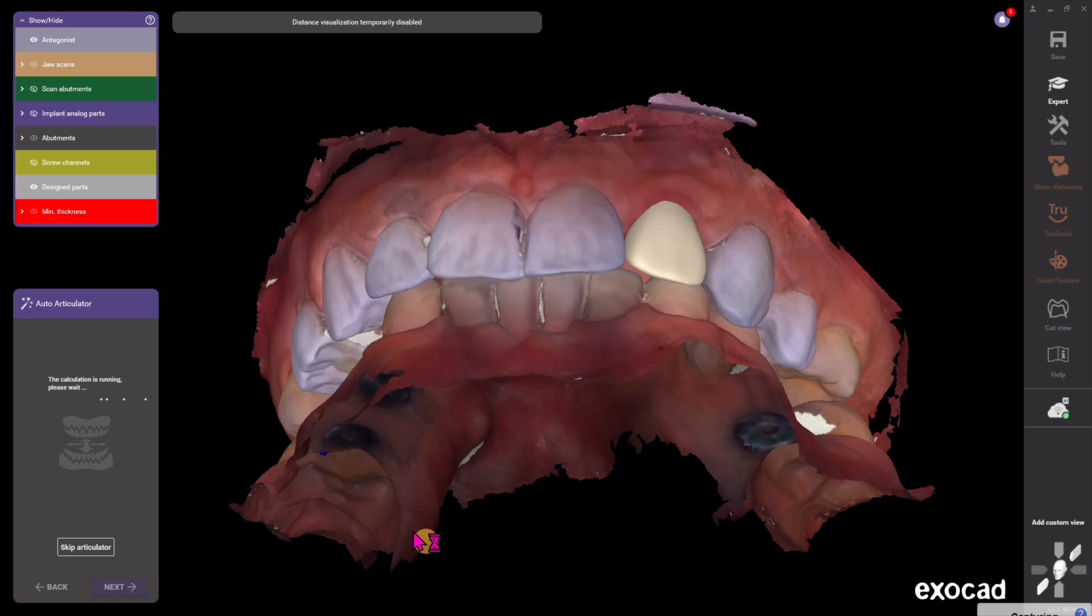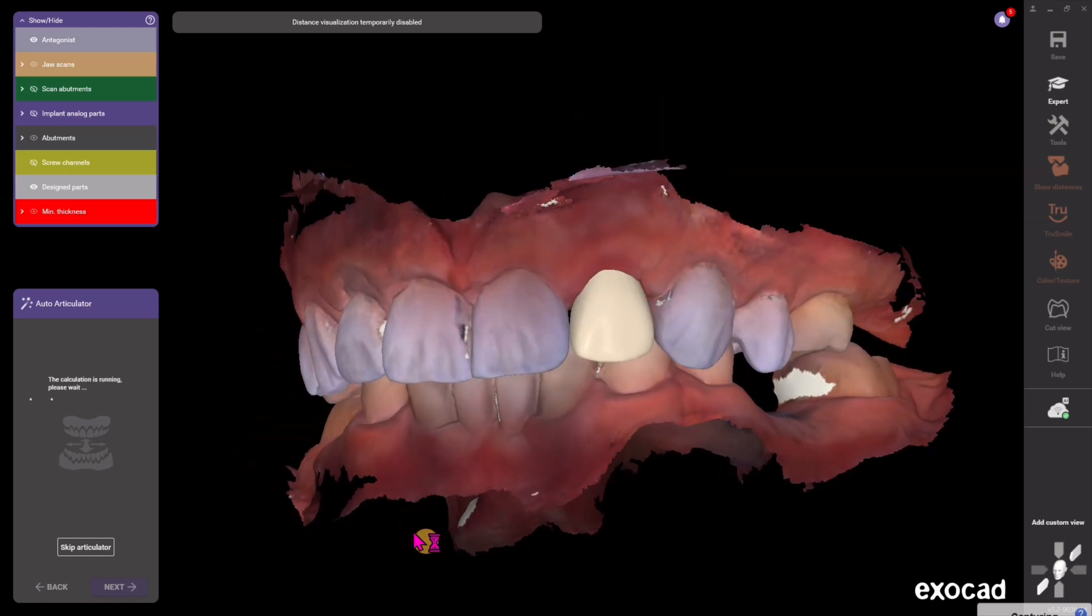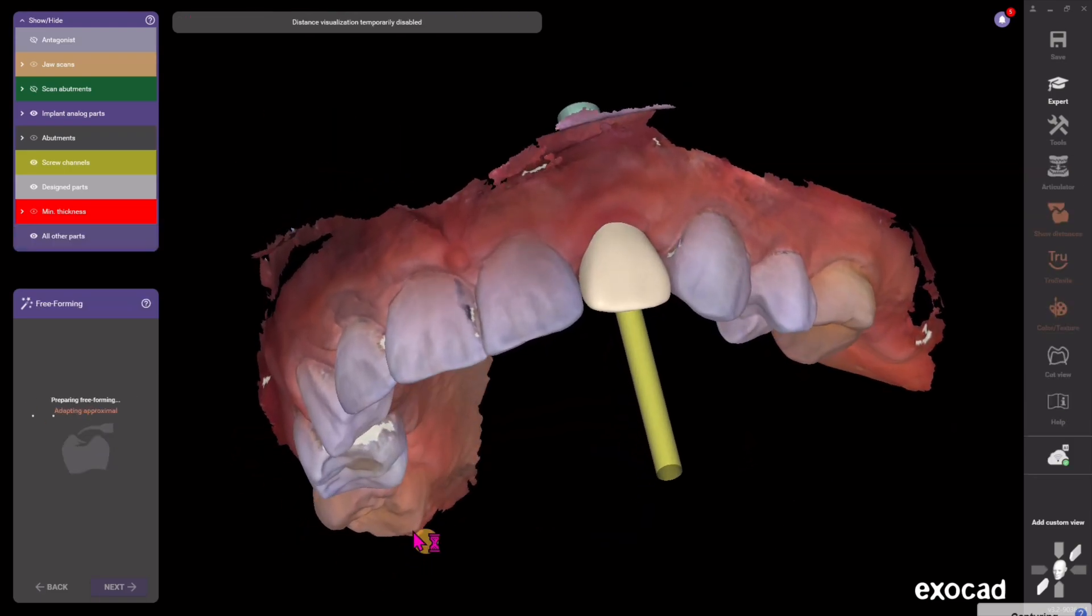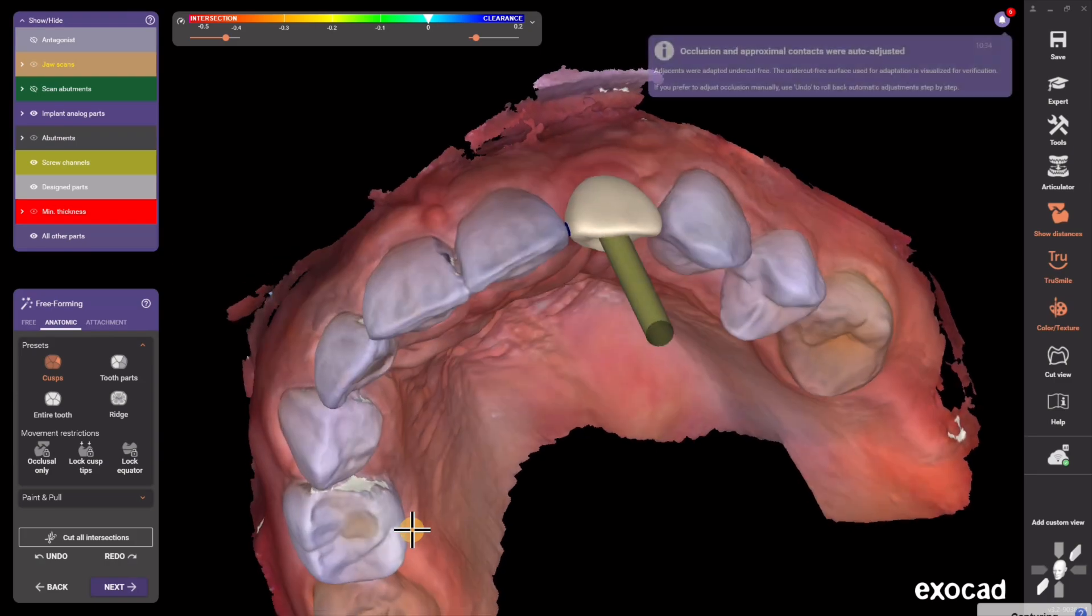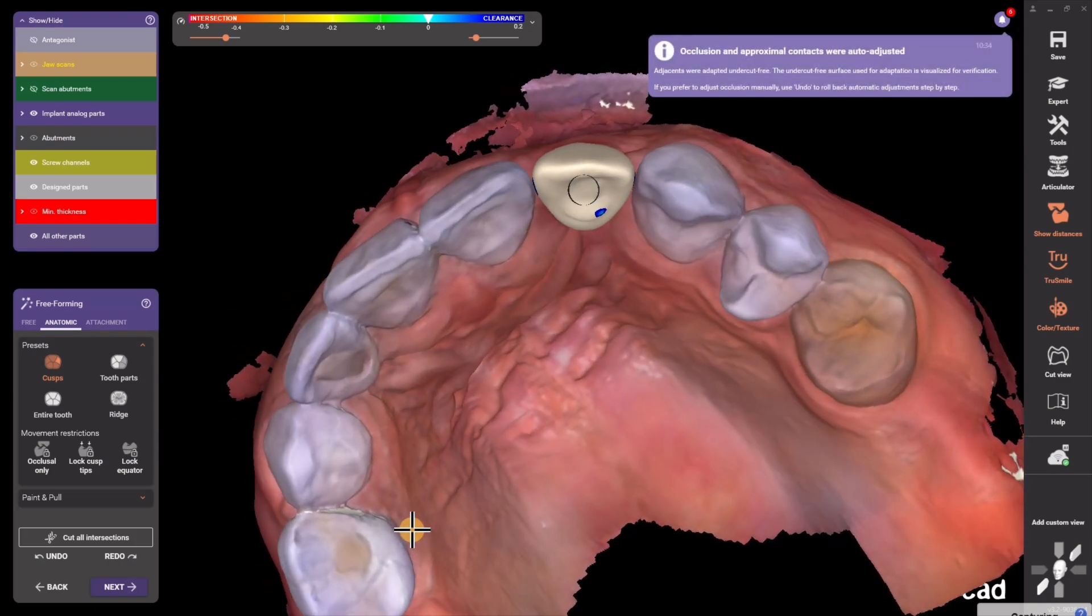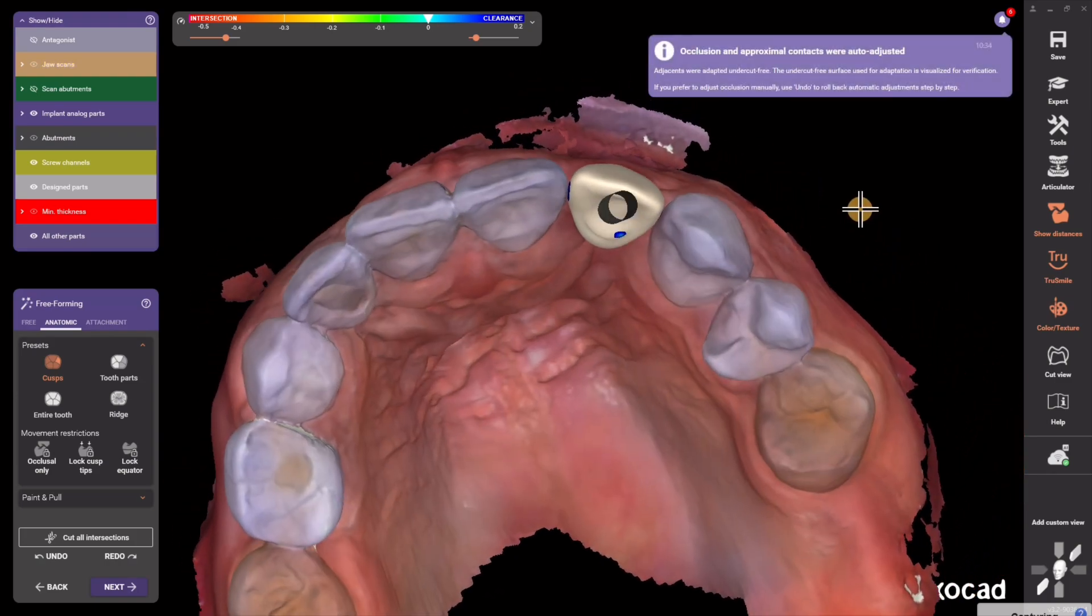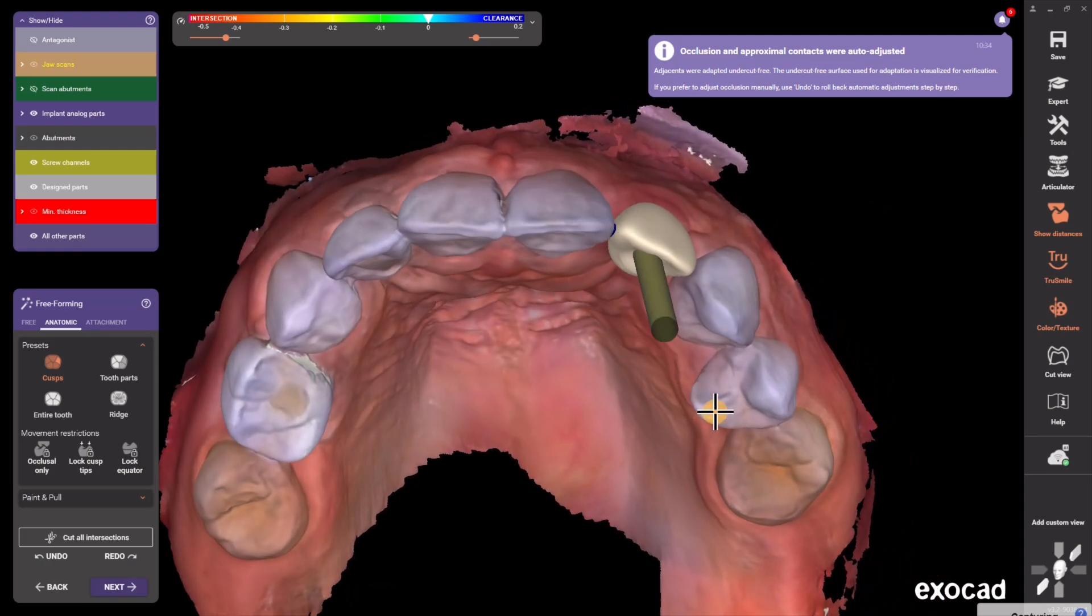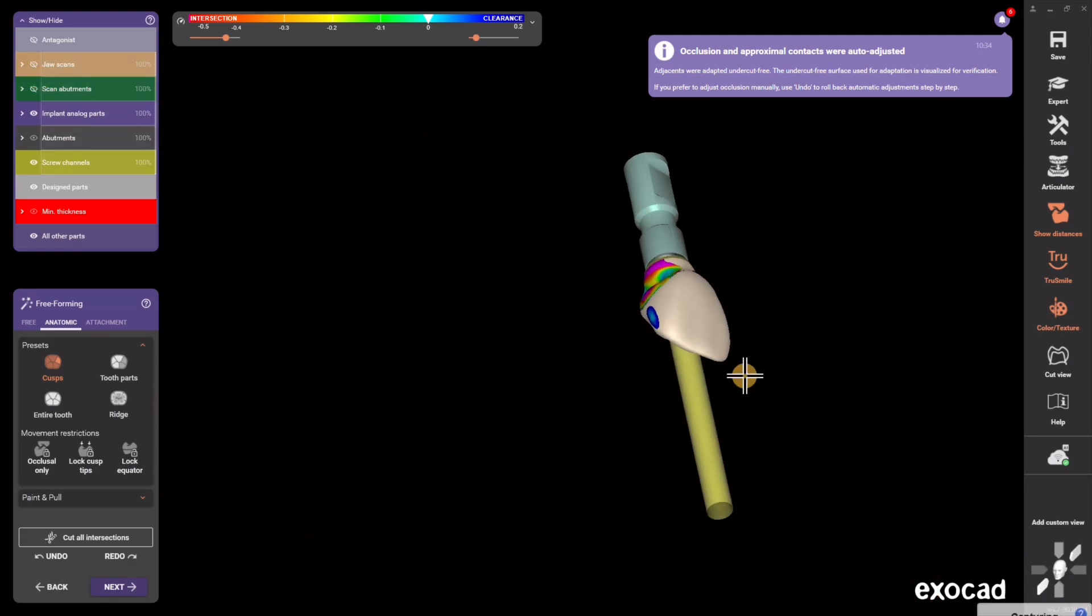I hit Next and it automatically creates dynamic articulation and a screw channel that will be through the implant restoration, and you're in the free-forming step. It auto-cut the occlusion and proximal contacts. It's basically nothing to do here.